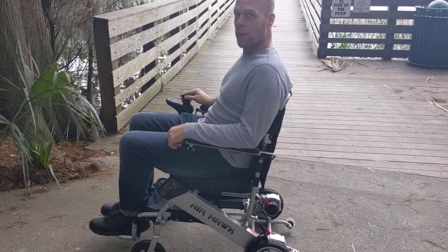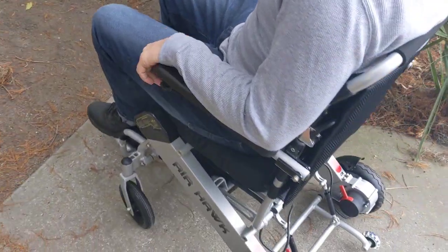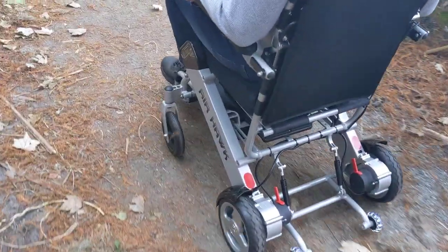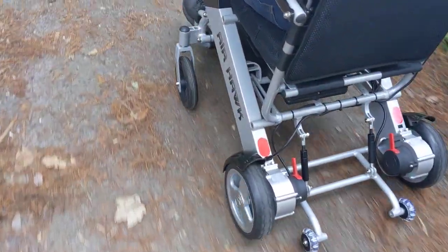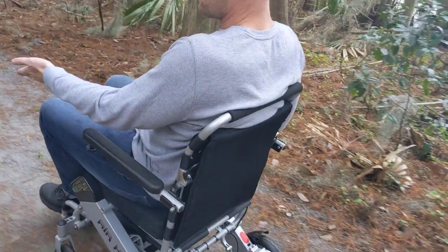So let's take a look at this chair and see what it can do. We're going over the threshold here, and I have the chair on the fastest setting. Mount Dora itself has a lot of hills, and it's relatively uneven on this path, but we can see how easy the chair handles it — no problem getting out and about so I can enjoy the morning nature walk.